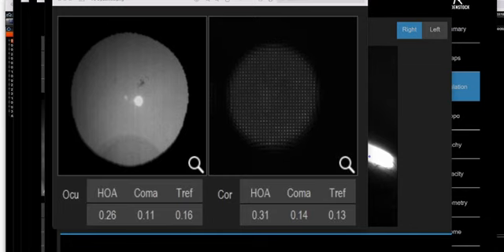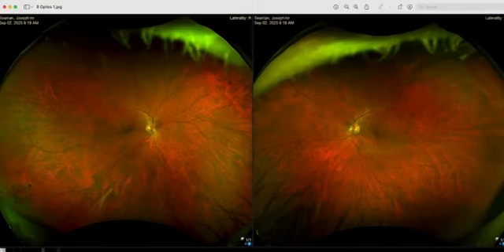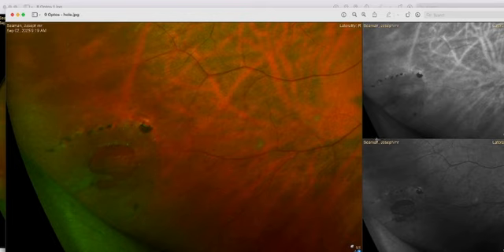Next, we're having a look at some retinal images, and first of all, our OptoMap retinal scanner. This is my right and left eye. This allows us to look at the nerve for glaucoma, macula for macular degeneration, blood vessels for the effect of diabetes, and then the peripheral retina. For me, I have a hole in my retina. You can see it down here, which I have to monitor carefully. This shows how the image allows us to zoom in on any imperfections and look at different perspectives. You see a general photo and then a measurement of the back and front of that structure.